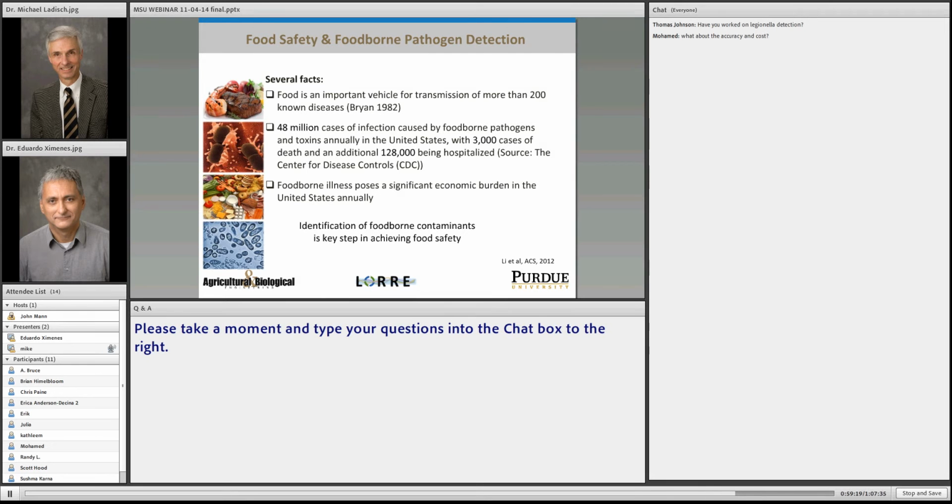In our case, because of the way the concentration microfiltration works, PCR inhibitors, as far as we can tell, are removed. So if we can get to about 1,000 viable cells, regardless of the method, the detection part done with PCR or other rapid methods seems to be consistent with plating methods, which would take a day.